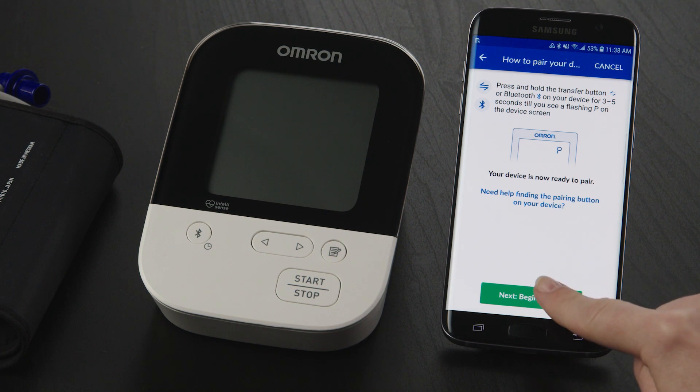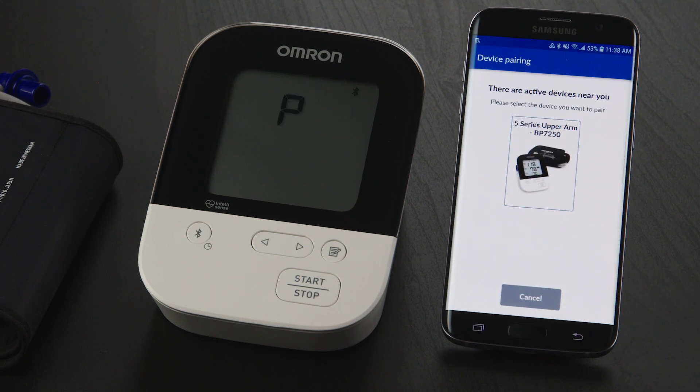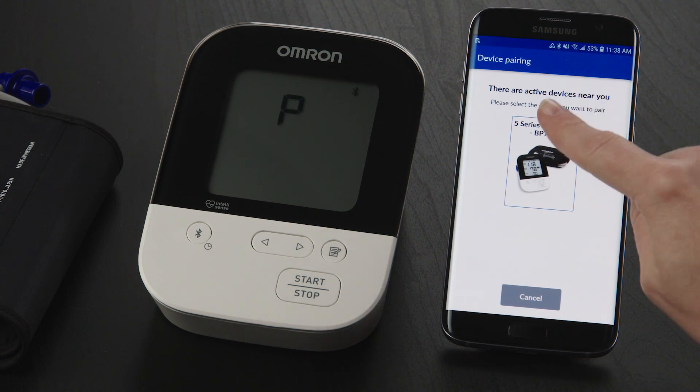Return to your phone and tap the Next Begin Pairing button. You may see a location prompt. If you do, simply tap OK and then select While Using the App. If you don't see a prompt, you may need to give location permission in your phone settings. On the next screen, tap on the photo of your Omron device.